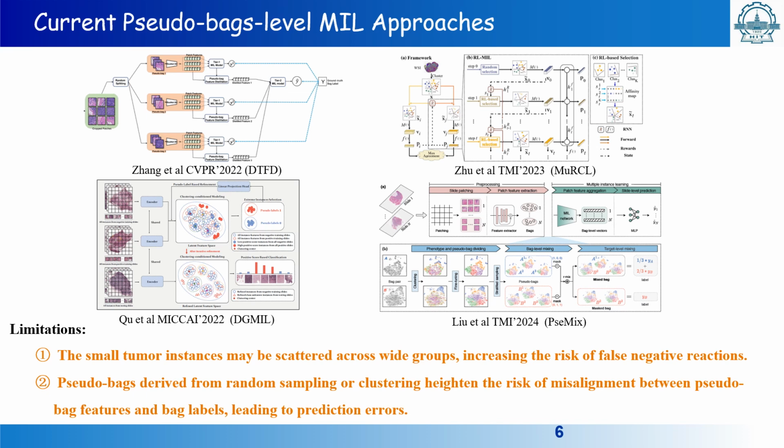By contrast, pseudobag-based methods leverage clustering or random schemes to decompose all instances, or embedding features into multiple classes or groups, denoted as pseudobags or subbags. Then, the bag labels are assigned to the pseudobags as pseudo-labels, resulting in substantial improvements. However, notably, the preprocessing for clustering and pseudo-label generation is tedious. Besides that, there are at least two other shortcomings.